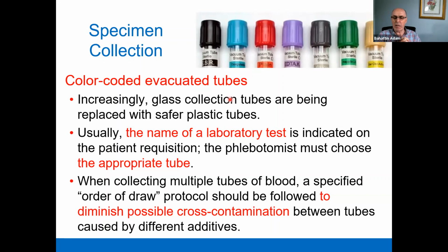Also, there is a directory manual in each laboratory that you can take a look at. It tells you which test requires which kind of blood, which test tube should be chosen, how we process the blood, and how we store such kinds of blood.